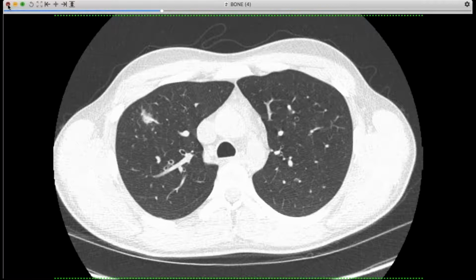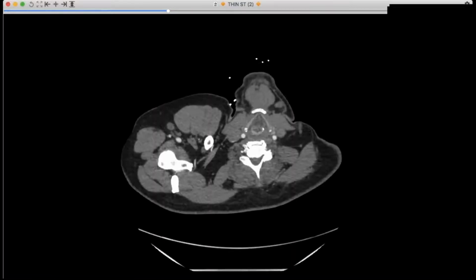Maybe those Cleveland Clinic cases were the ones that were referred down the line. Yes, it was a large vasculitis clinic, so maybe so. Because you're right, you typically see that later on in the disease. Now, this is an interesting case from an imaging morphology appearance.